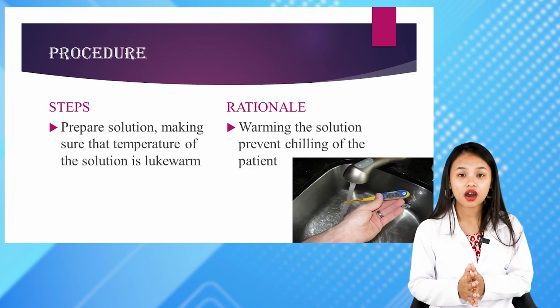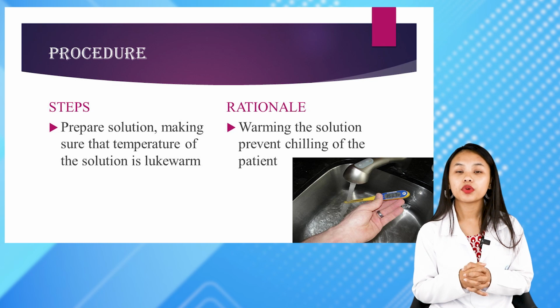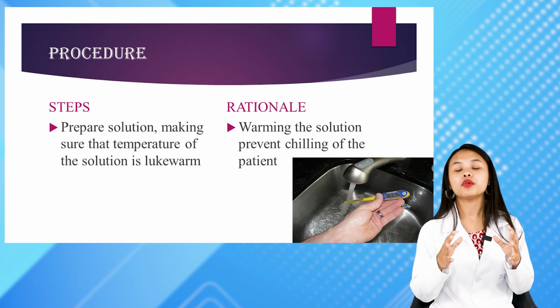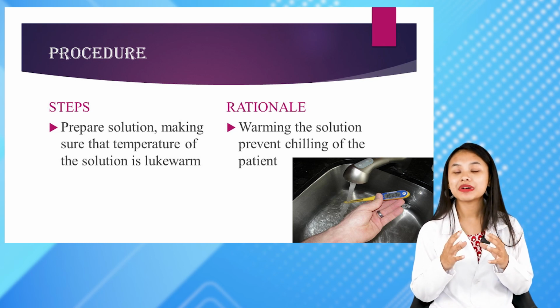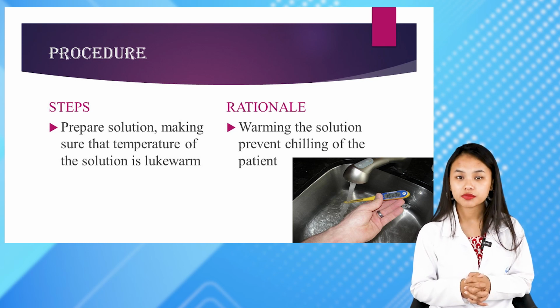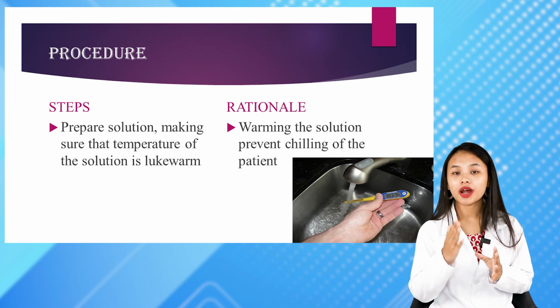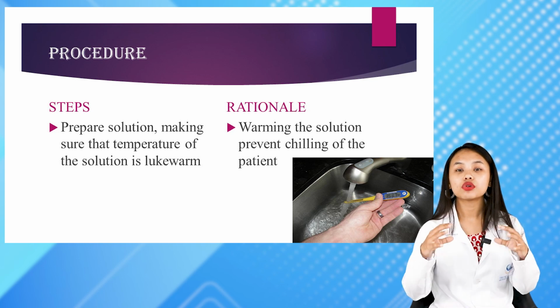Then we can start preparing the solution. While preparing the solution, it is very important to keep in mind that the solution must not be hot or cold; it should be lukewarm.